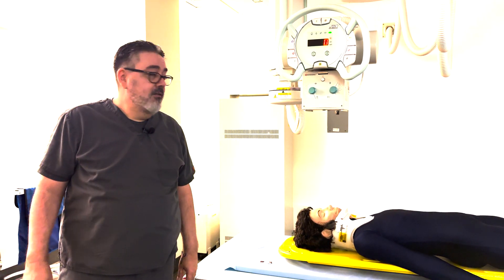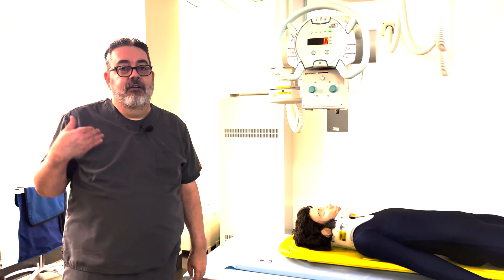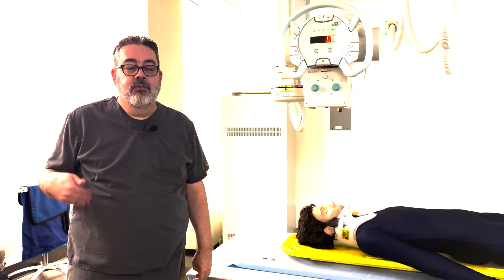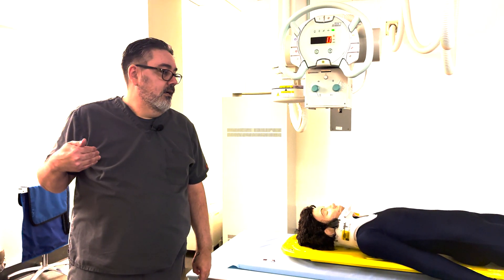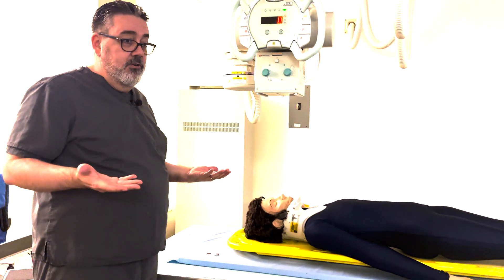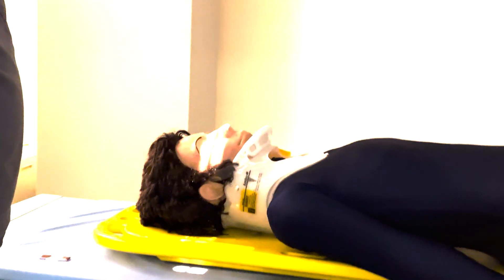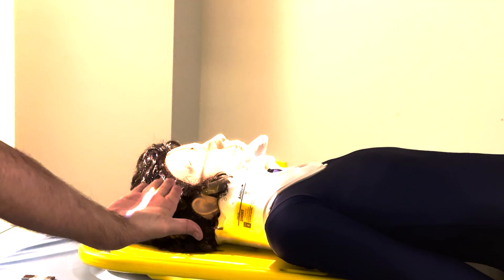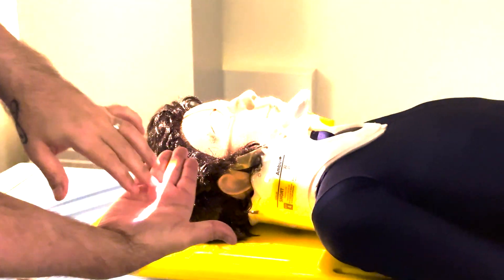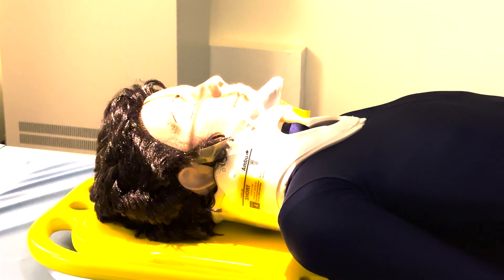First off, we need to do our AP. The petrous ridges need to be presented filling the orbits. So for that, our central ray needs to be parallel to the OML. There's a trick I've always used: use the collimator light — the one on the side that you can angle — to line up with the Bucky. You can use that or the crosshair to angle to the OML.